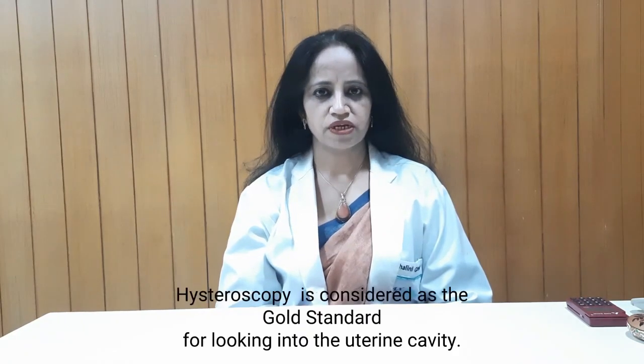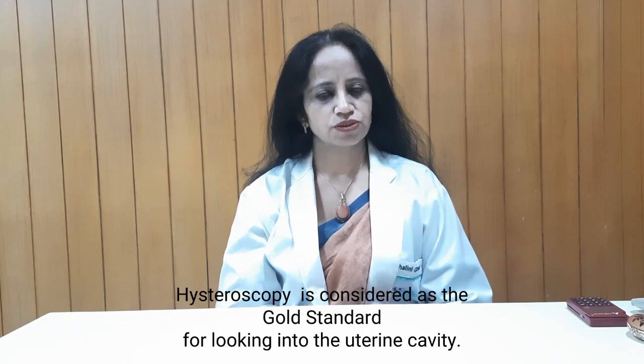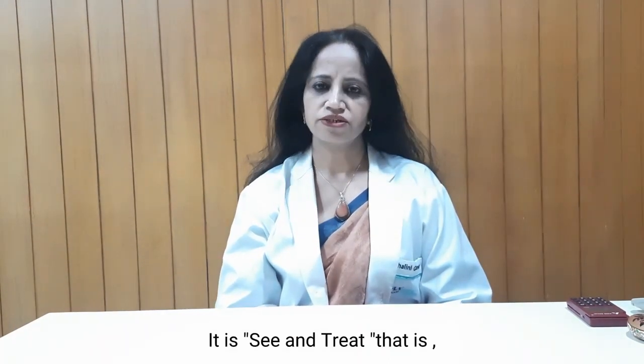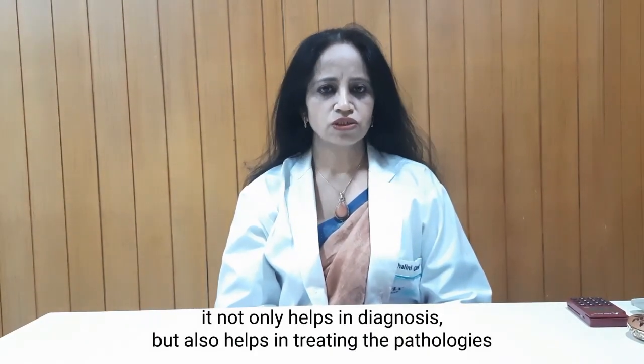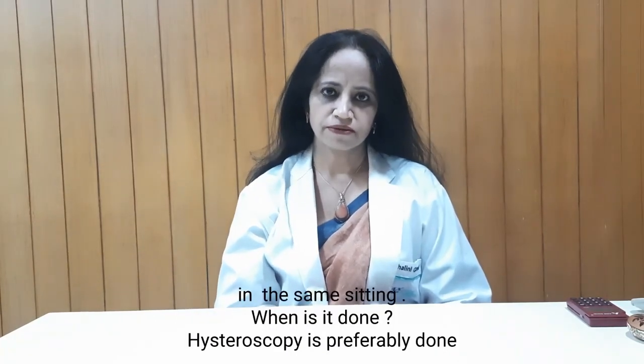And hysteroscopy is considered the gold standard for looking into the uterine cavity. It is see and treat. That is, it not only helps in diagnosing but also helps in treating the pathologies at the same sitting.